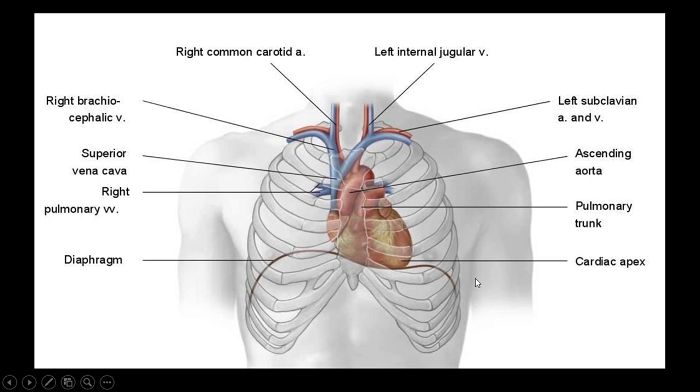For parasternal long axis access, as we know, some part of the heart is not covered by the lung, which we call the cardiac notch. It's almost at the level of the left sternal border between the third and fourth intercostal space. That is the best spot for scanning of the heart in left parasternal. But when we turn the patient to the left or right, this spot will change a little. Just keep it in your mind.